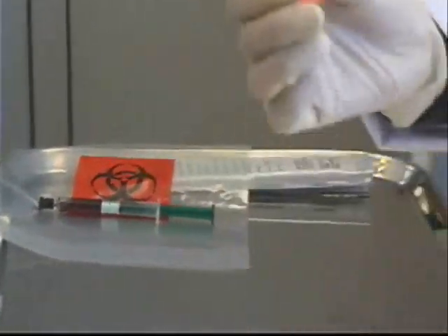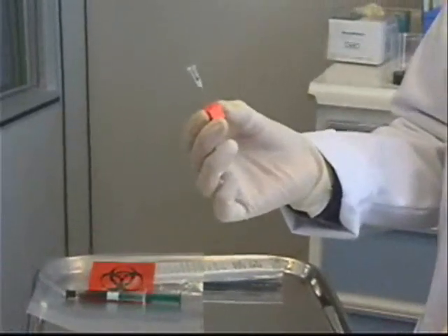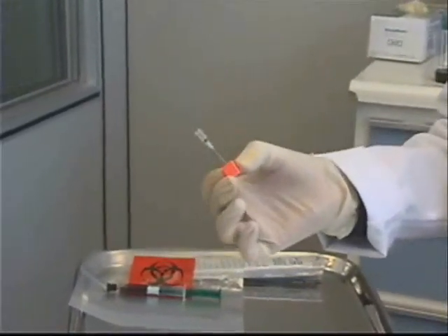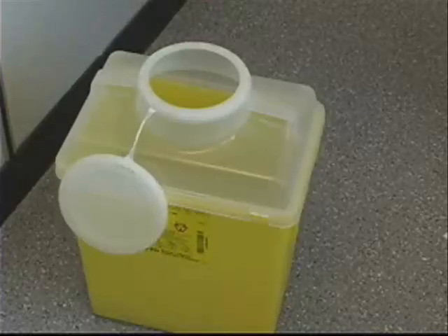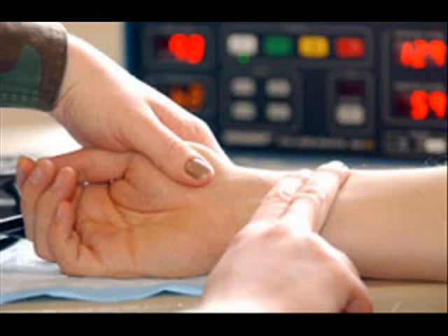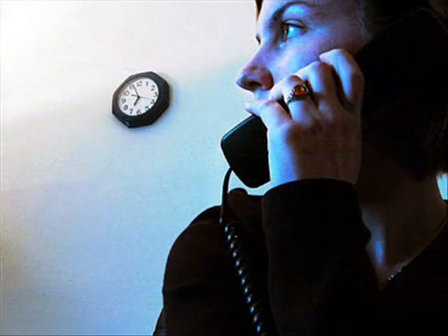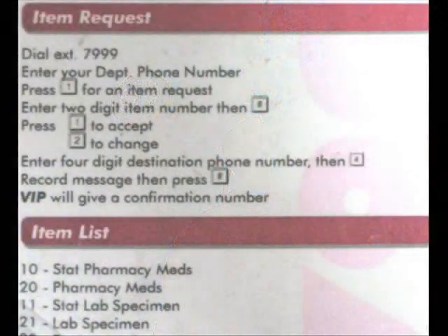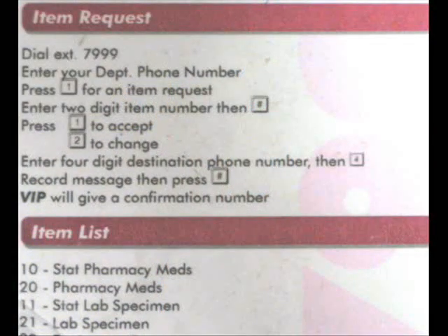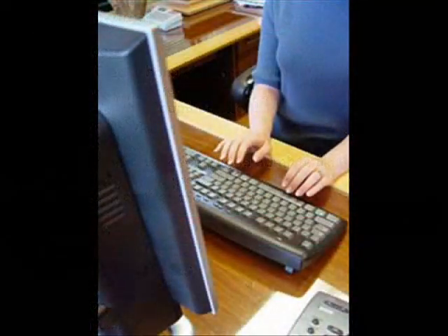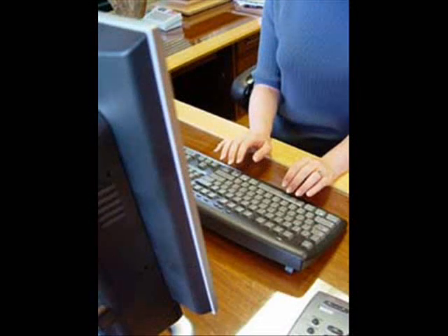My last step is to dispose of the needle and cube in the proper sharps container. Once pressure has been maintained for either five or ten minutes, check for a pulse distal to the puncture site. Page according to the site protocol, status the blood gas sample in the computer, and document appropriately according to site policy and procedure.